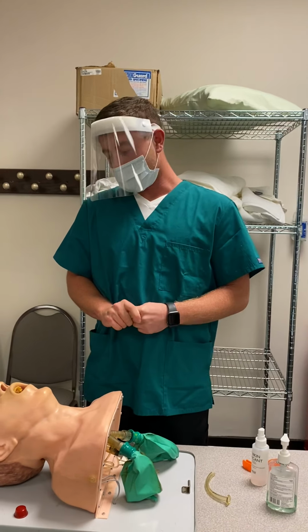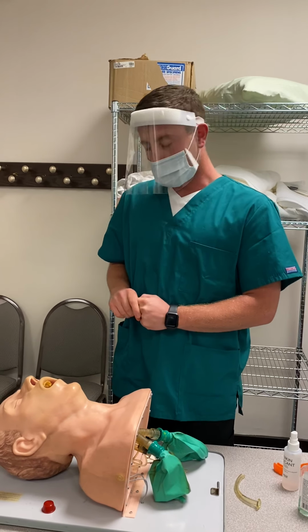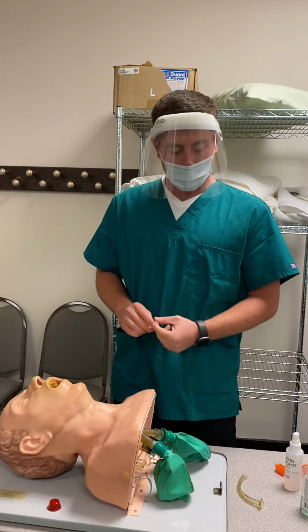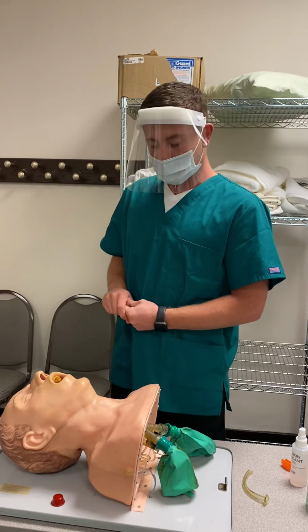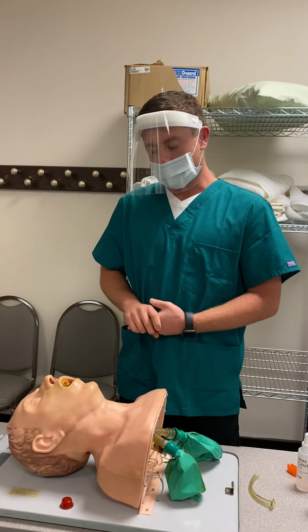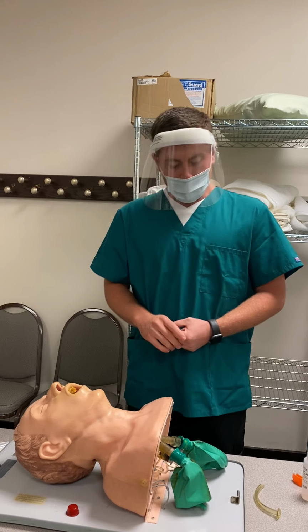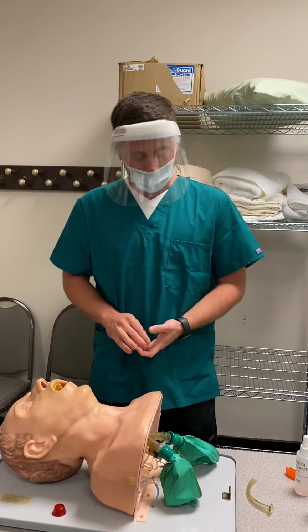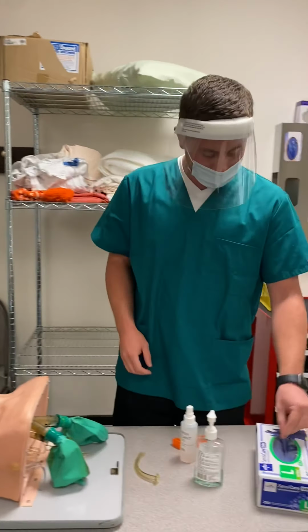Hello, my name is Gordon McCall. I will be your respiratory therapy student today. The doctor has ordered us to perform a nasopharyngeal airway insertion, which is just a little tube to make your breathing easier and open your nose. Can you verify your name and date of birth? Thank you. Now I will perform proper hand hygiene again.